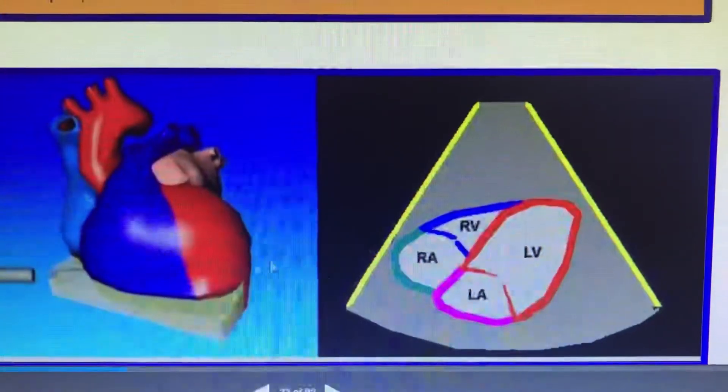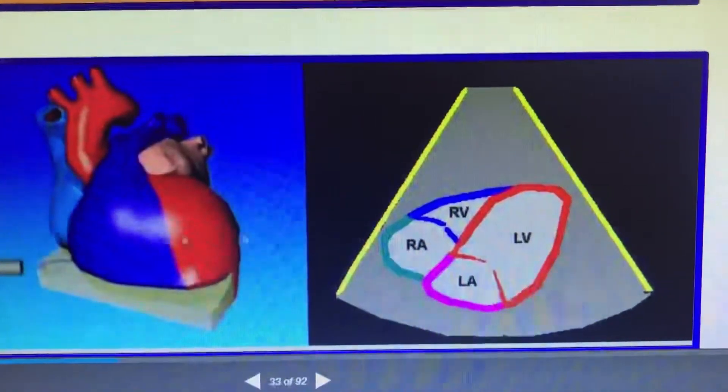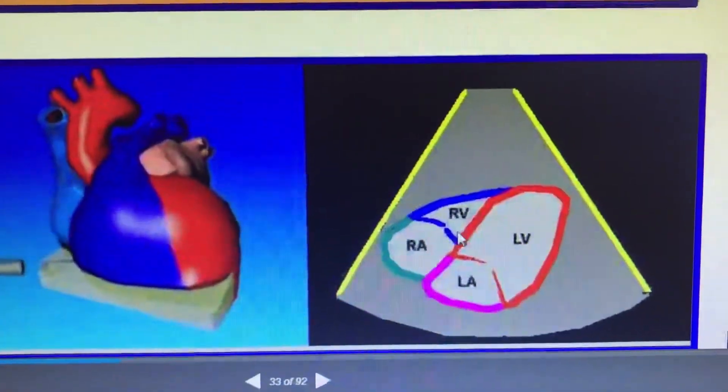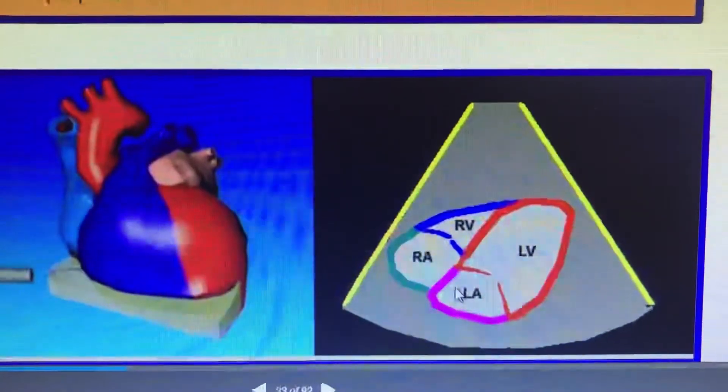This is the subcostal view. In the subcostal view, the probe will be looking at the base of the heart, and it will be seen similar to the apical four-chamber view, but with more precision towards the RA and LA.